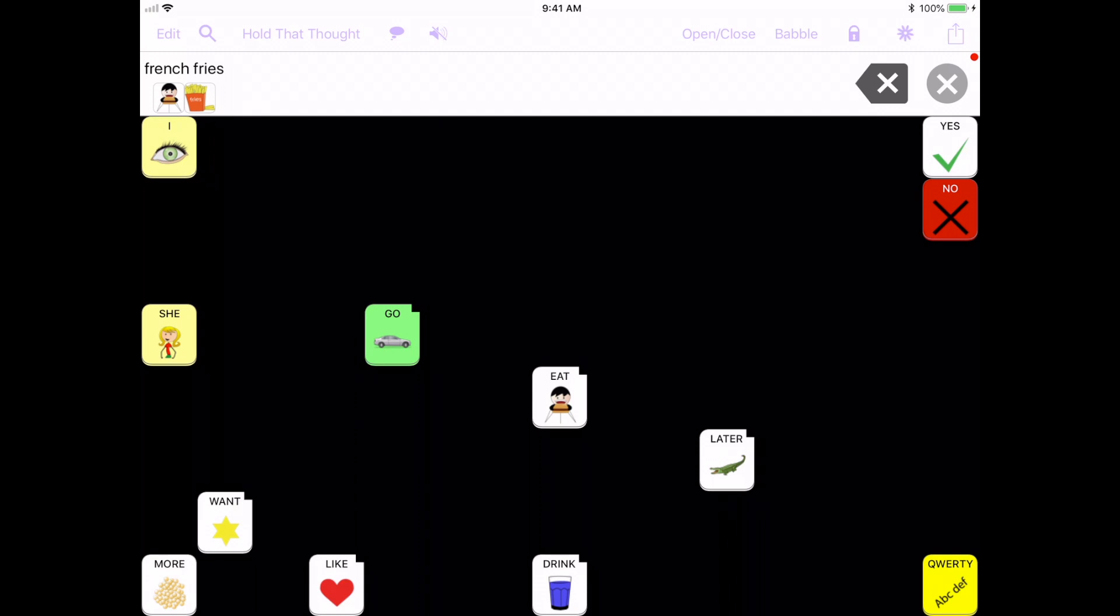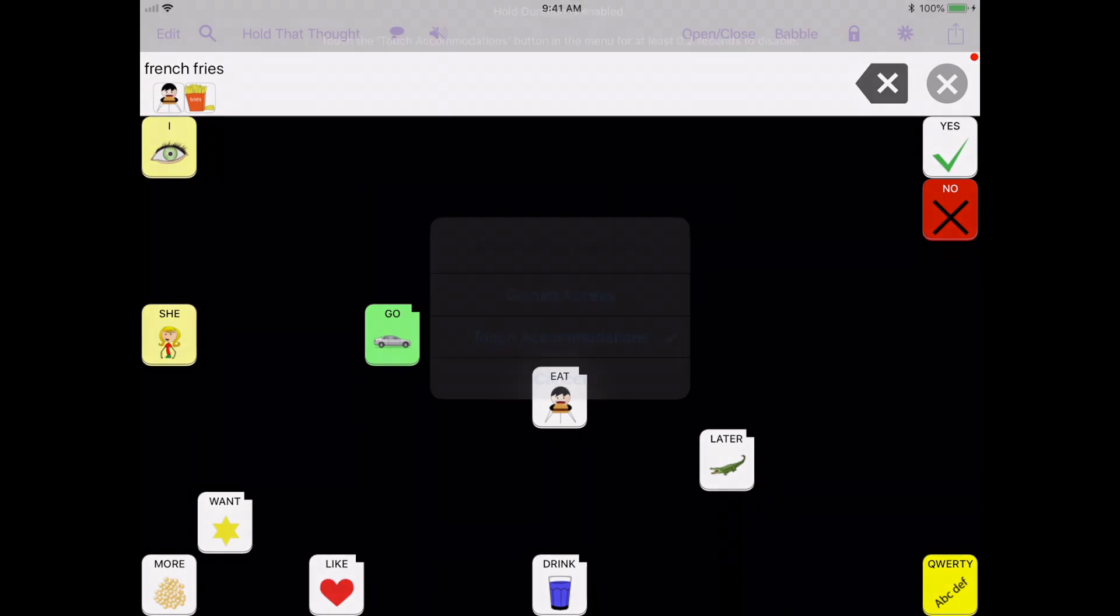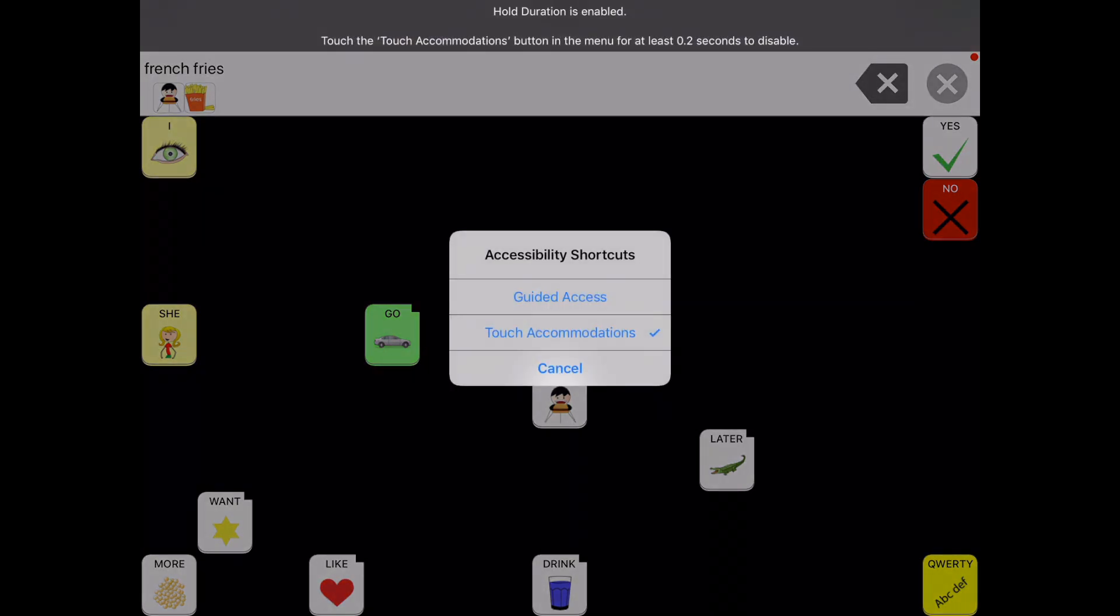The other thing to remember about this is that if you're in guided access you can actually put touch accommodations on a shortcut along with guided access. So if you want to be able to turn touch accommodations off for when you're moving within the iPad, you can do that through that same shortcut where you hit the home button three times. And you see when I do that it gives me the accessibility shortcut. So it's asking me if I want to go into guided access or if I want to do something with the touch accommodations. So I would be able to, if I selected touch accommodations it would disable the whole duration that I just set, and of course if I go into guided access it's going to put speak for yourself into guided access.